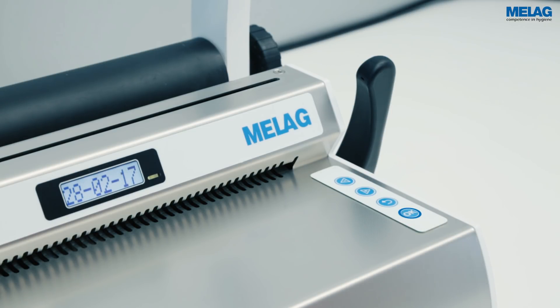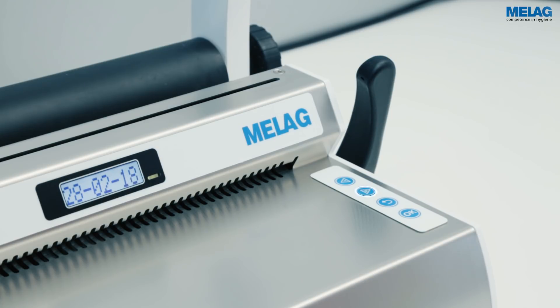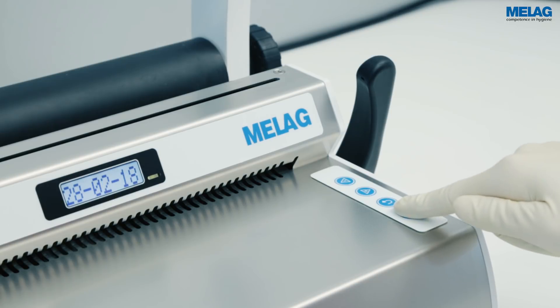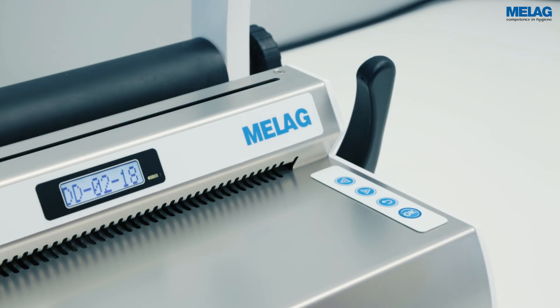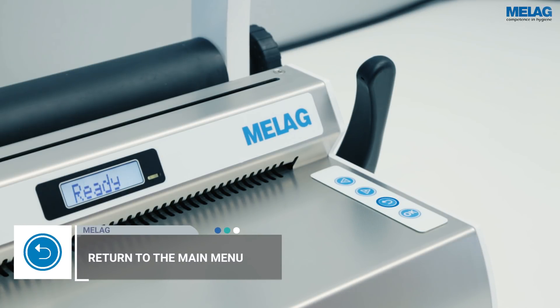Adjust the year that flashes on the display by using the plus and minus keys. Press OK to confirm the selection and continue with the setting of the month and day. Subsequently, save your entry with the OK key. Pressing the curved arrow key repeatedly enables you to leave the menu.